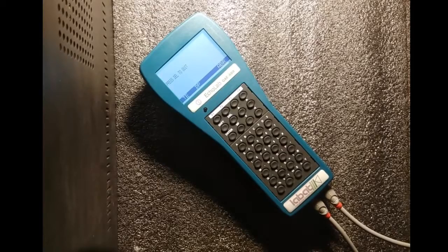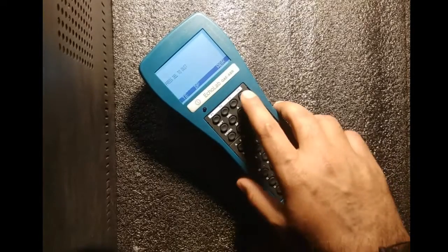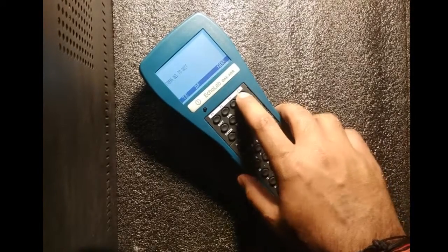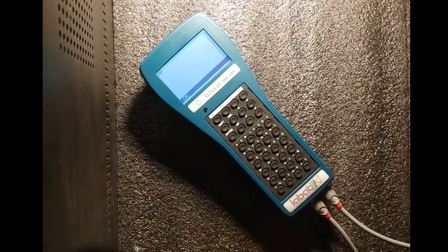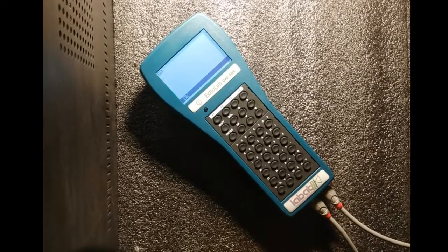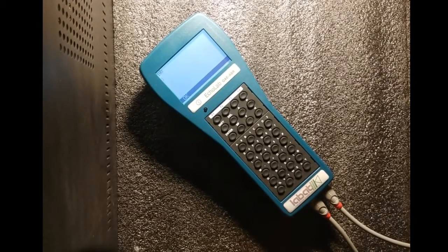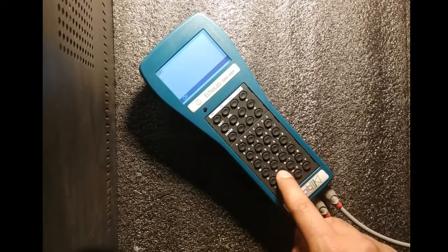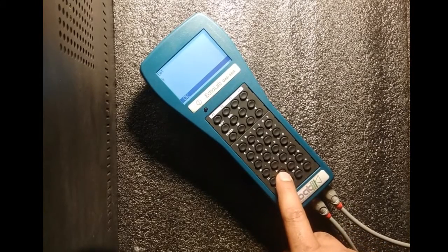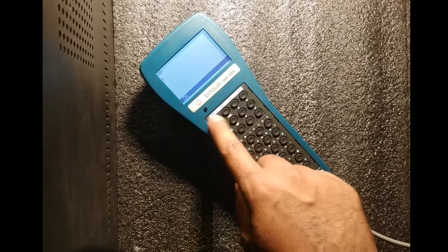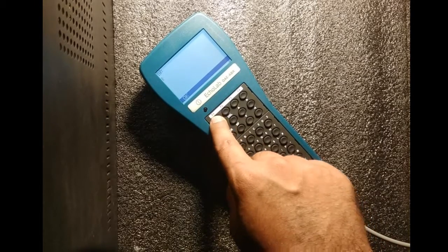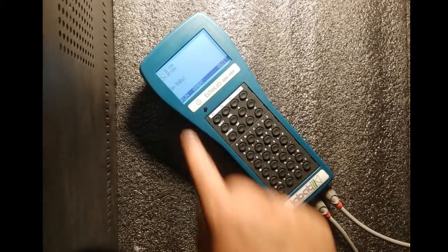Once you have made the connection of the electrodes on the patient, you will hit F4. It will ask which ear you want to put the probe in - that will be the testing ear. We are testing the right ear, so I am hitting R for right. You can hit L for left. After that, we will press F1. You can see the impedance is quite low.